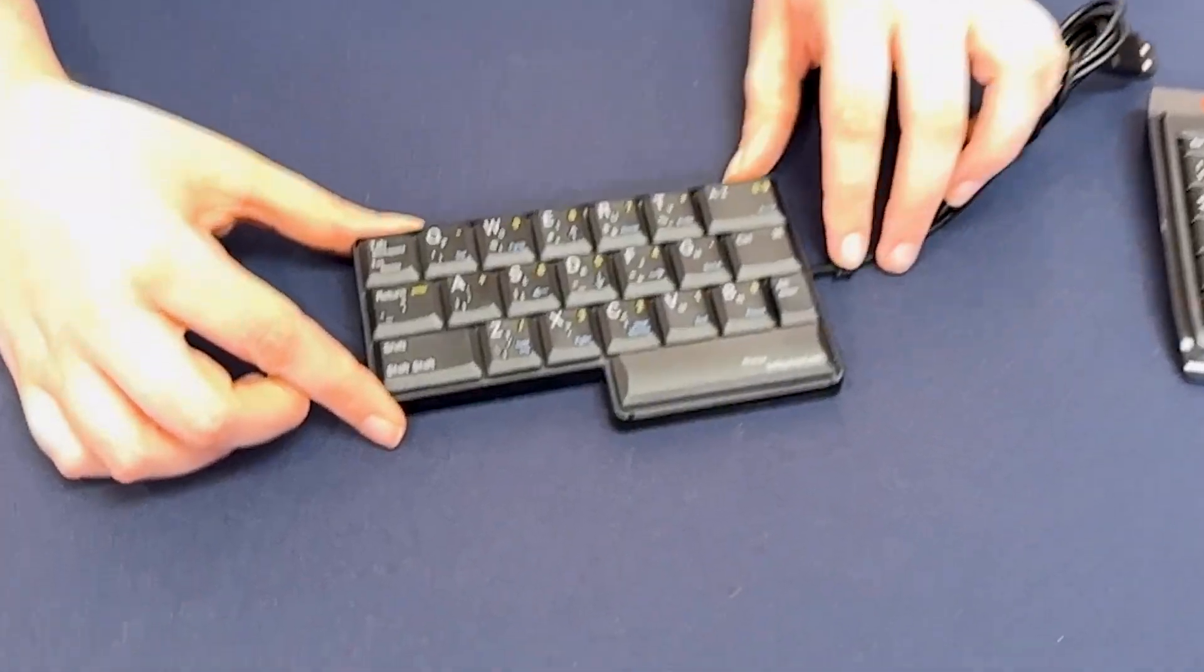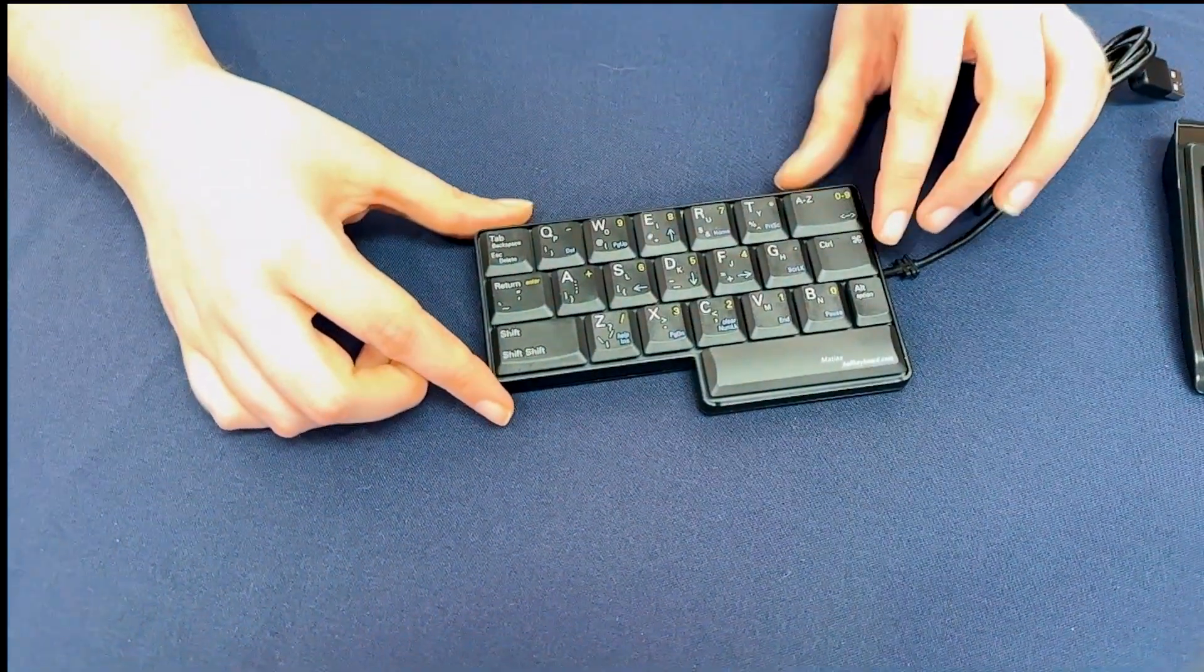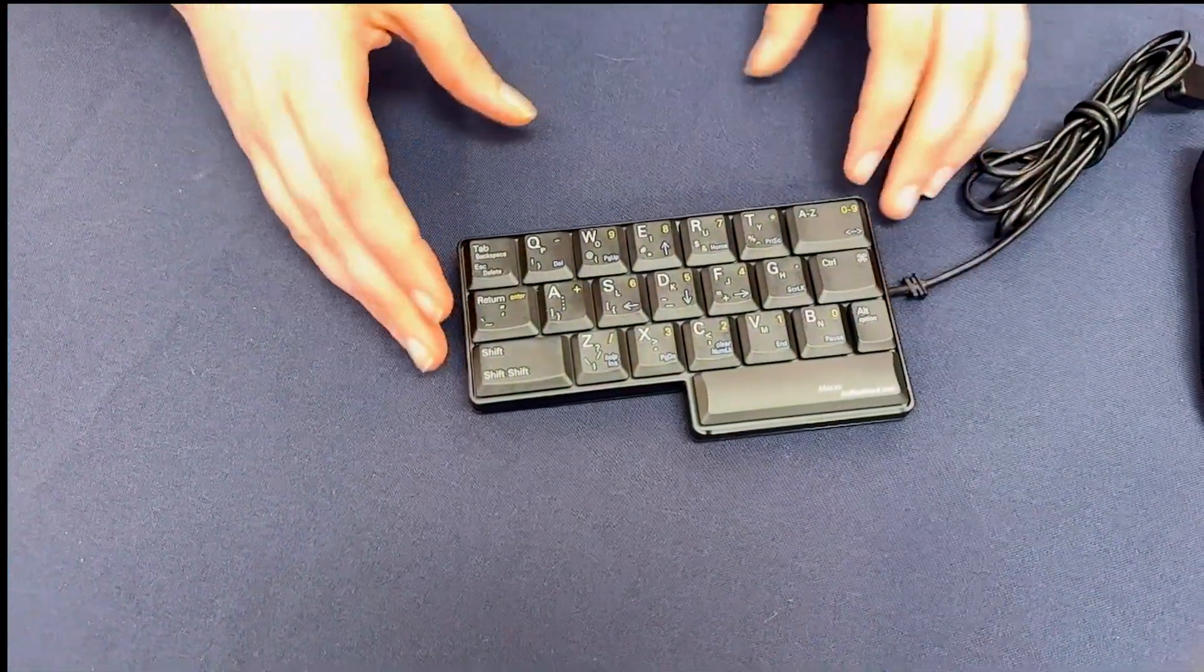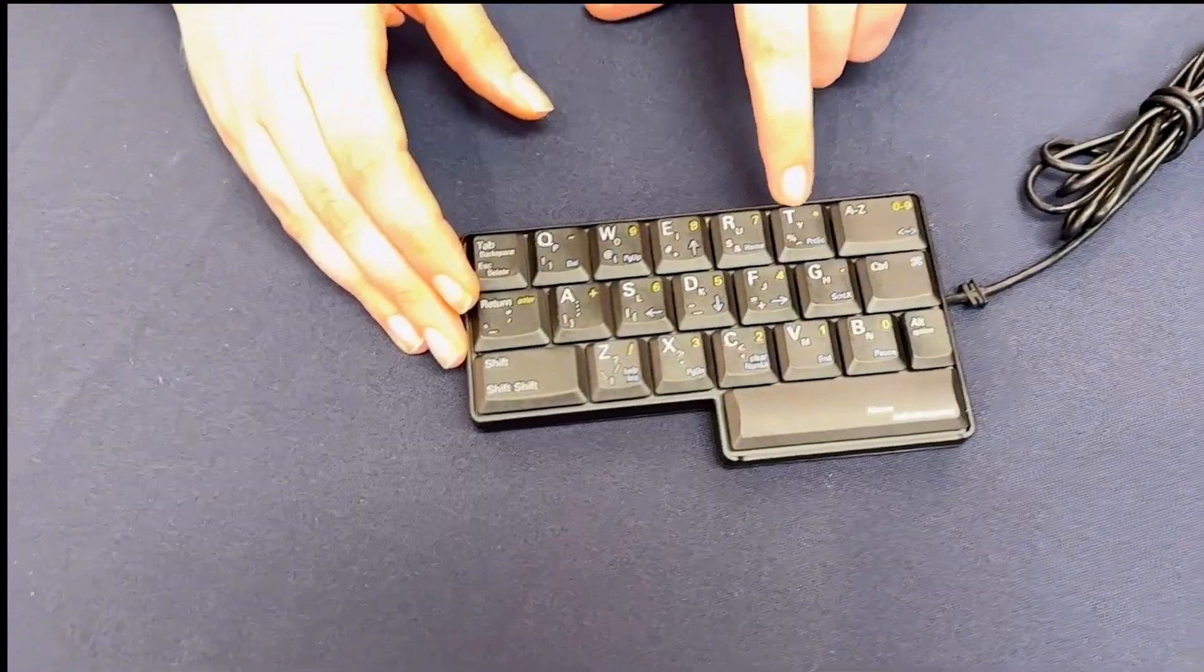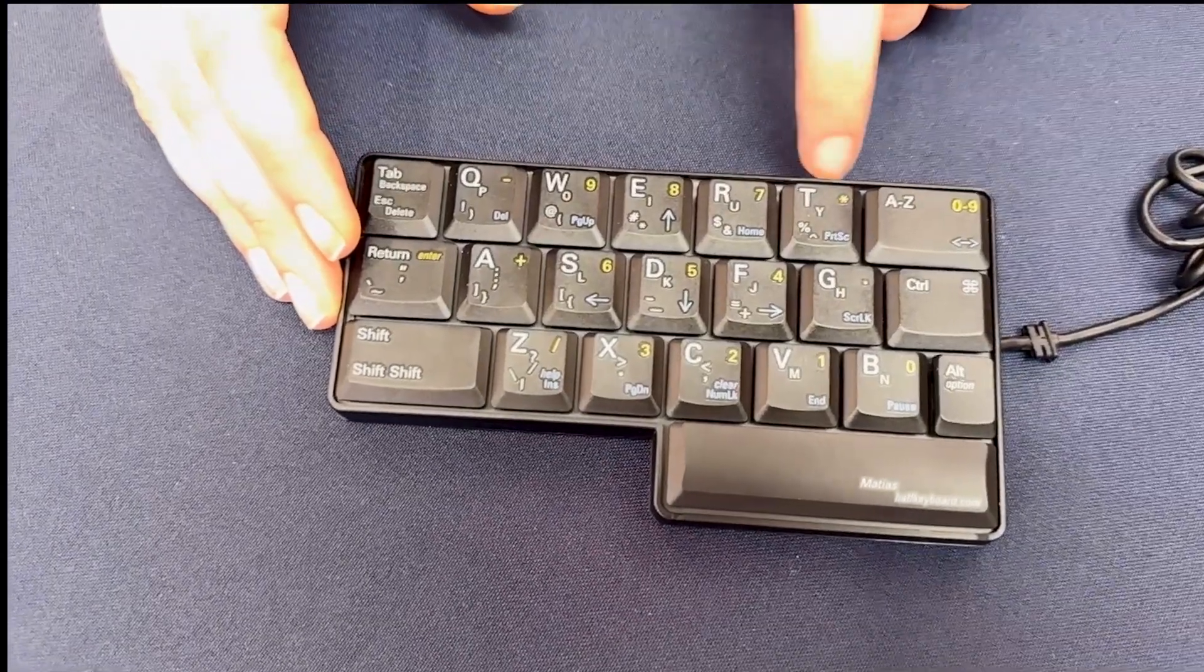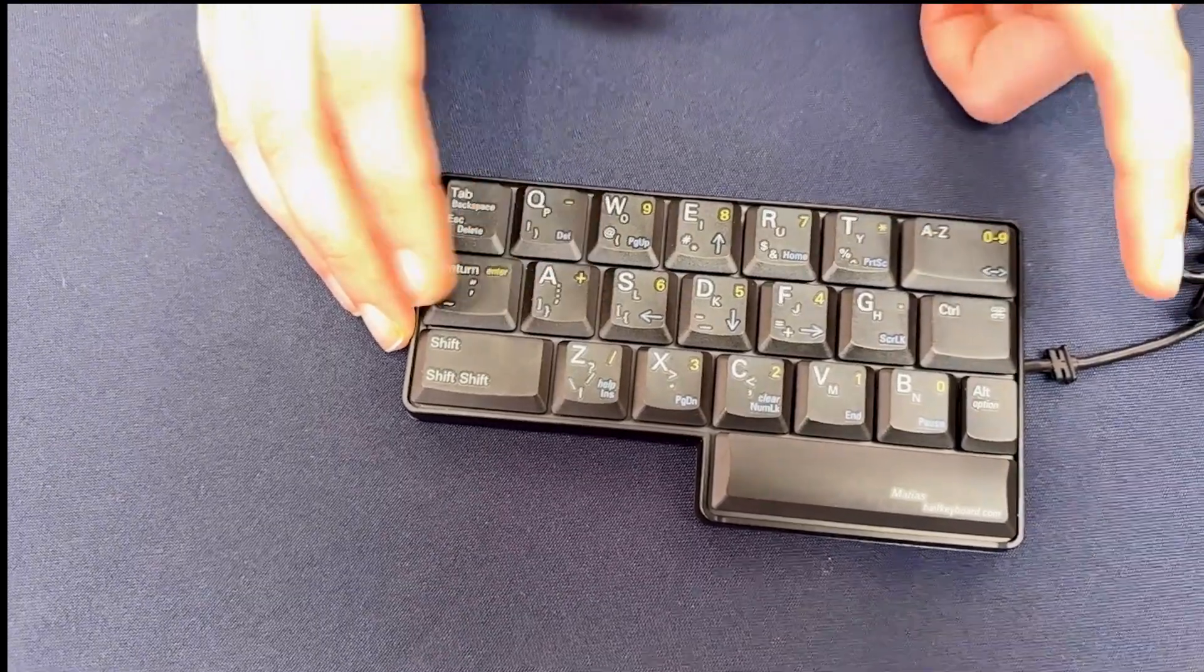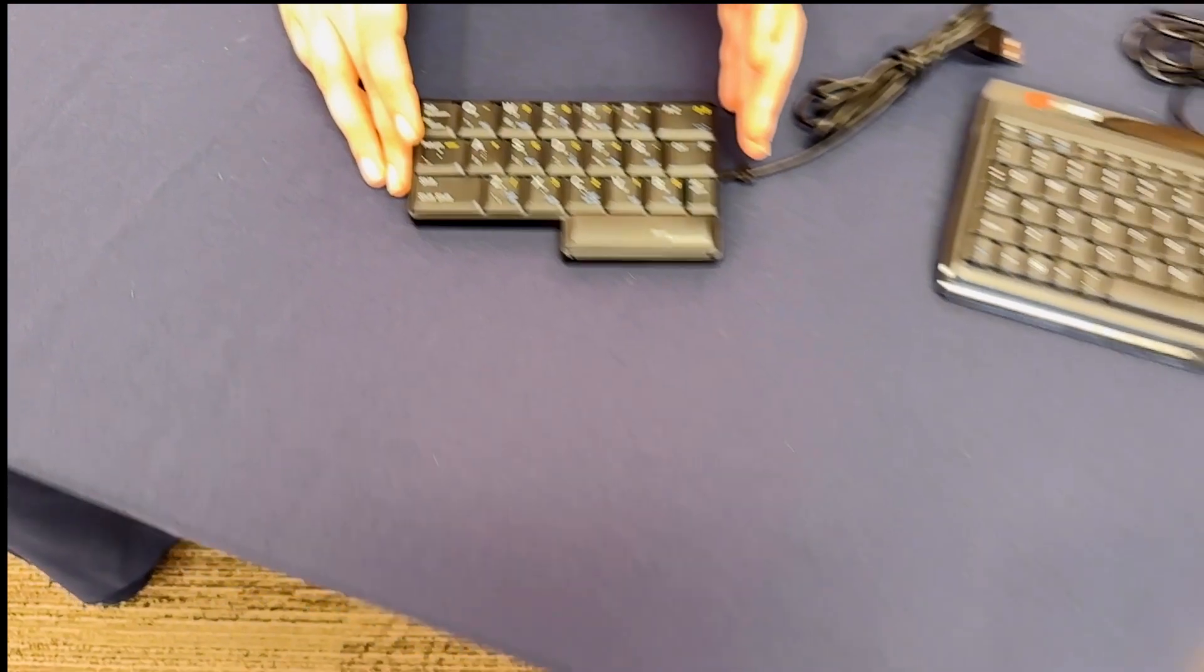This keyboard has all of your keys and symbols on just a half keyboard. Each key has two different letters associated with it, as well as two different symbols. Depending on which keys you press in which order, you can get all of the different functions of a full-size keyboard with just one hand.